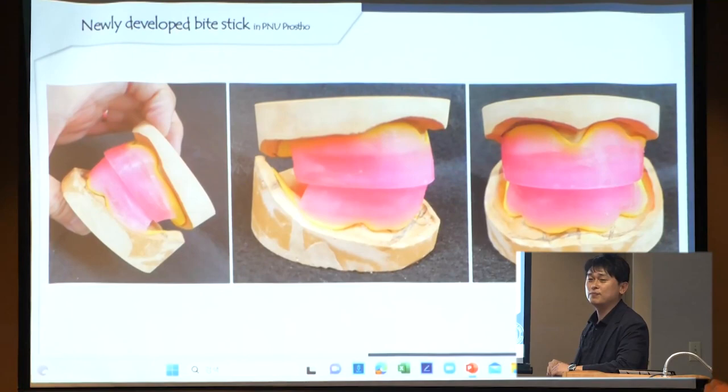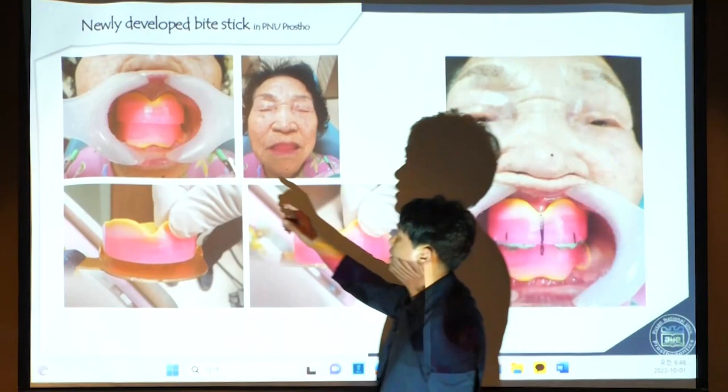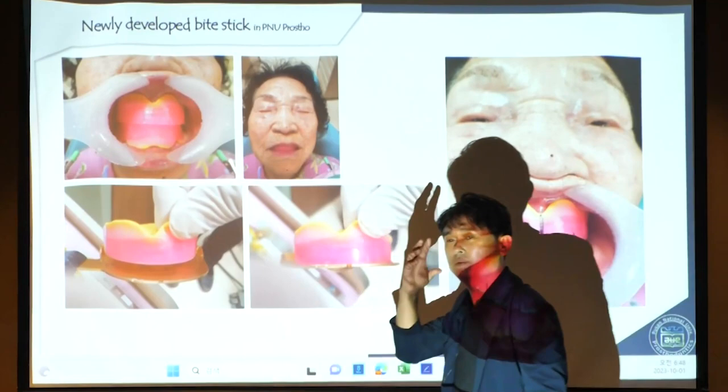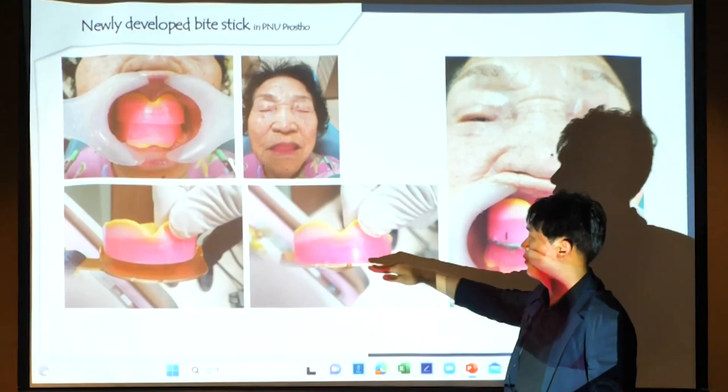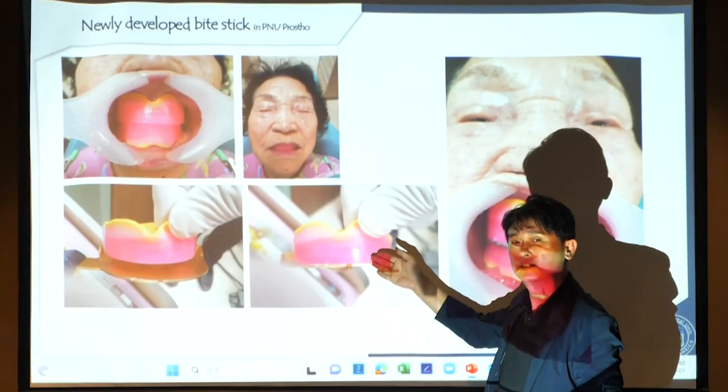So after using this PAPO system, you can see the very even contact occlusal plane after delivering the wax rim in the oral cavity. And then you can adjust the vertical dimension at the first time, you know, without adjusting another plane. You are always melting or adding vertically, not adjusting the incline of the occlusal plane.